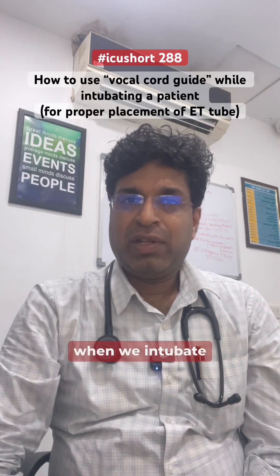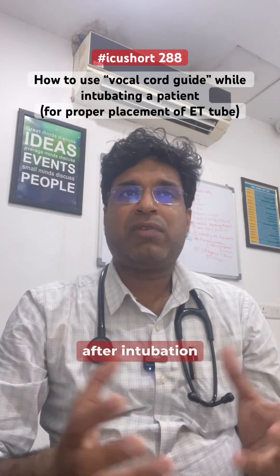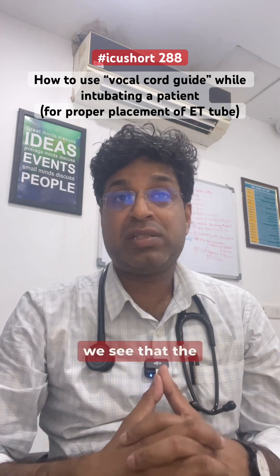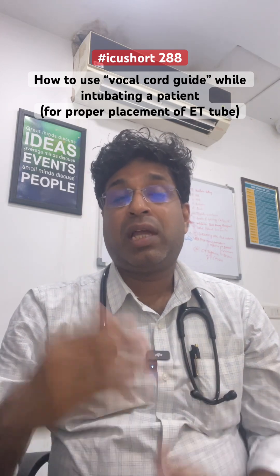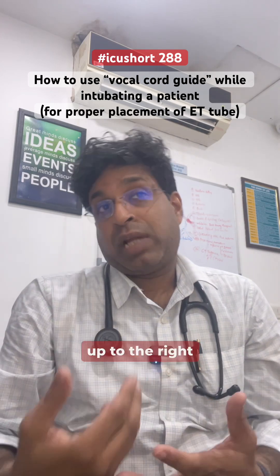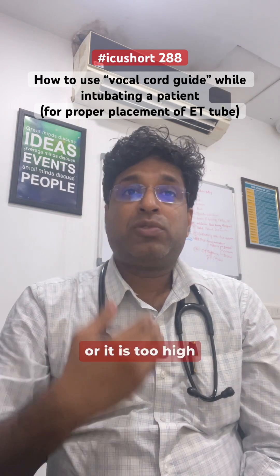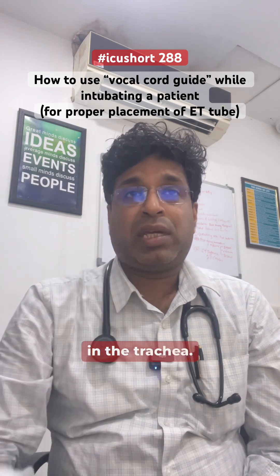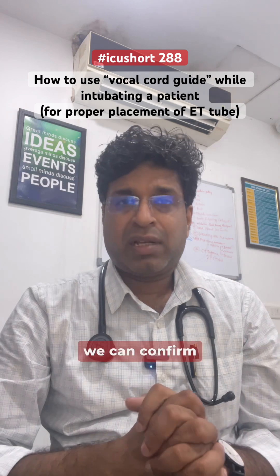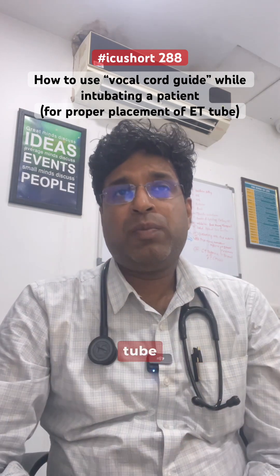Many times it happens that when we intubate a patient and after intubation when we do an x-ray, we see that the endotracheal tube has gone too far down up to the right bronchus, or it is too high in the trachea. X-ray is a good modality by which we can confirm the position of the endotracheal tube.